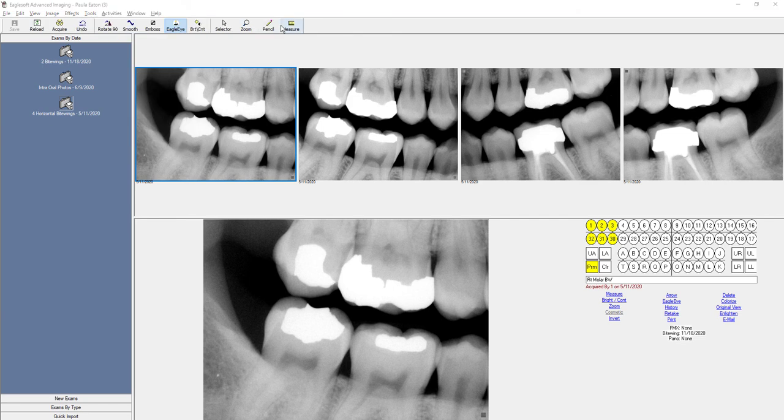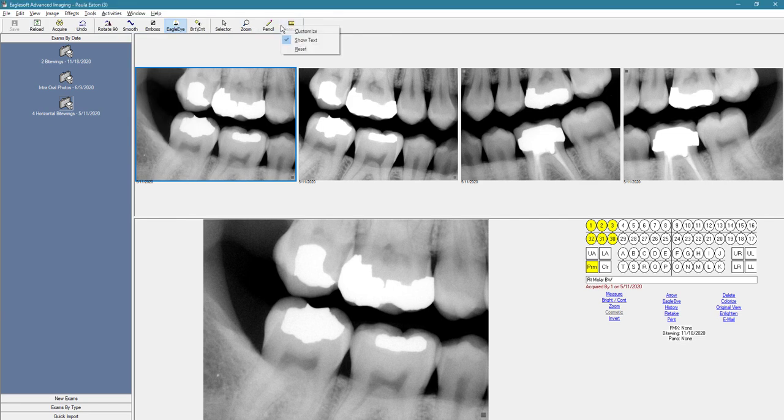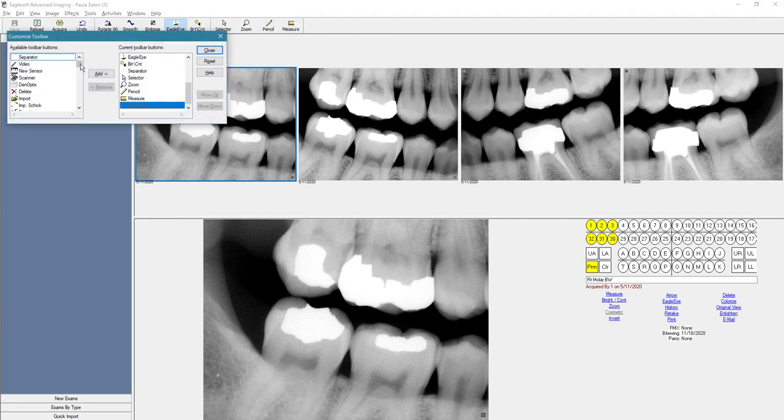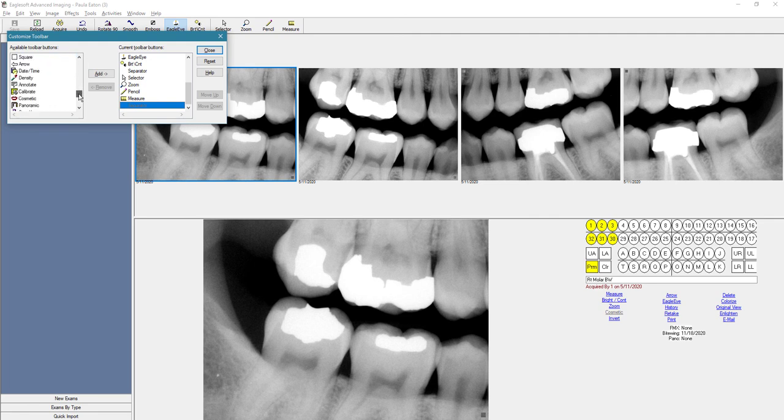So you just need to right mouse click on the toolbar and then click on customize. And then we're going to find the tool we're looking for and then add.